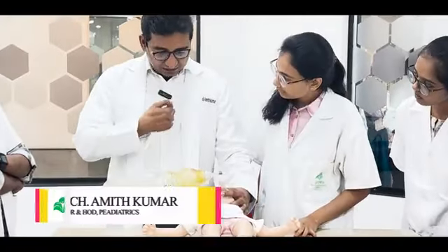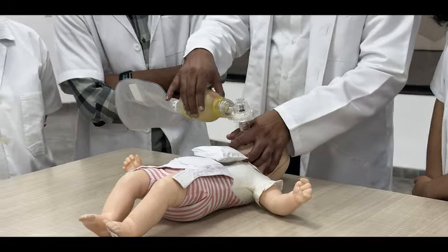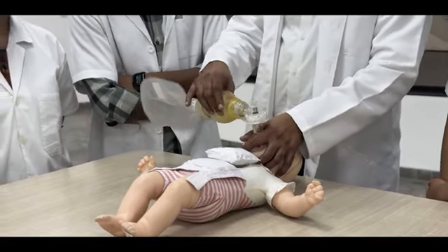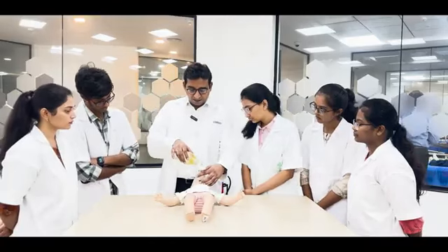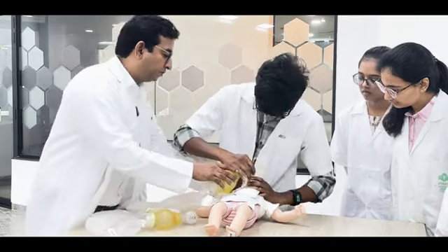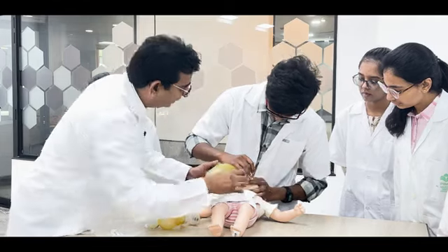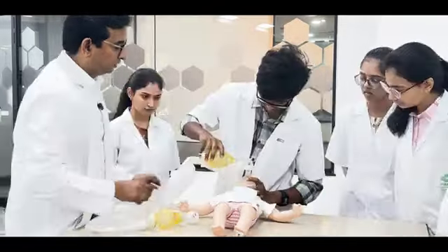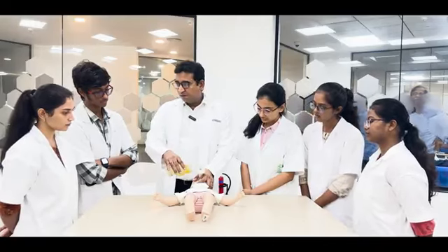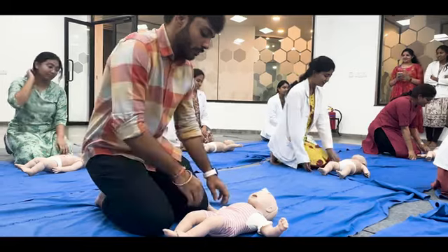If you do the flexion, the airway gets obstructed. When we start doing bag and mask ventilation, you see there is no respiration and no heartbeat. So this is how to do a bag and mask ventilation. You need to have a bag, the baby lying there. You need to cover the entire nose and the mouth with the bag and mask, and you have to give breaths, and you can see the rise and fall of the chest as well as the rise and fall of the lungs. This is the way you can revive the newborn baby. The repetitions will be 3 chest compressions and 1 breath. This is how you can revive the baby.